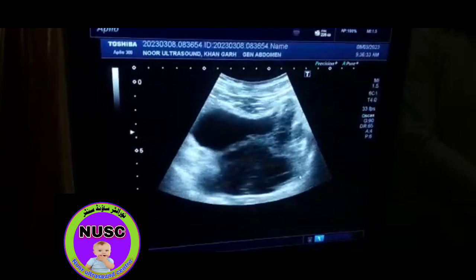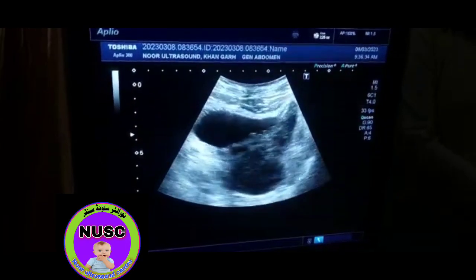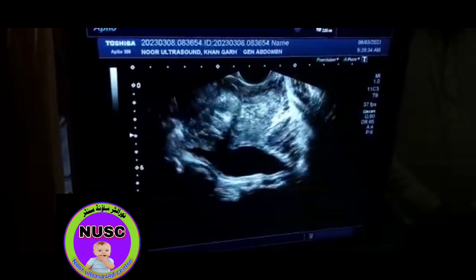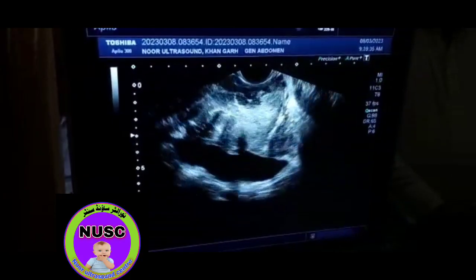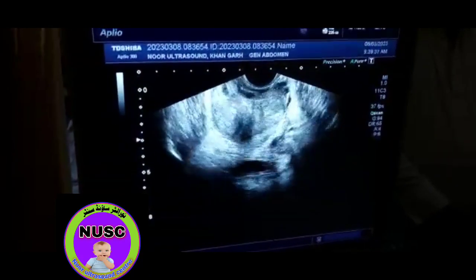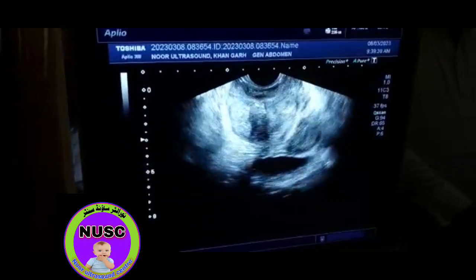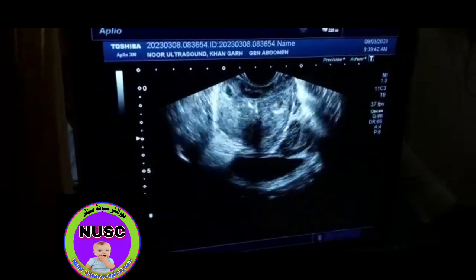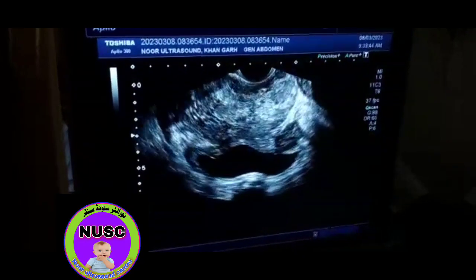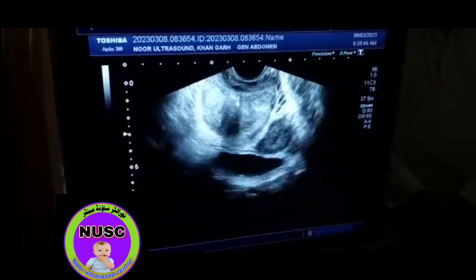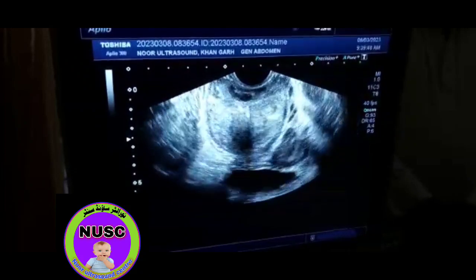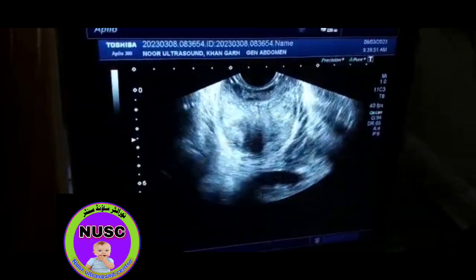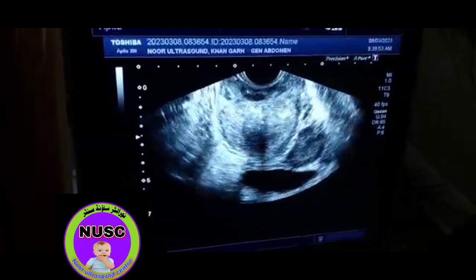We will now perform the transrectal ultrasound for further confirmation. On transrectal ultrasound, as you see here, this is the prostate. It is about 53 grams. As you know, malignancies most of the time originate from the peripheral zone.